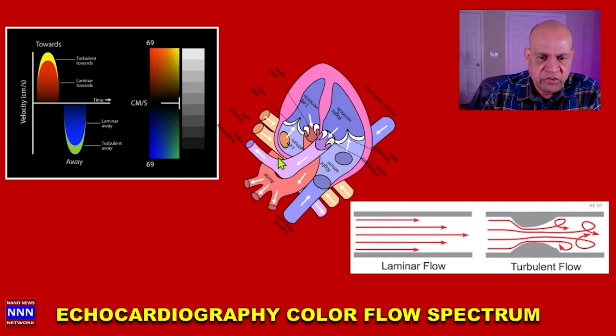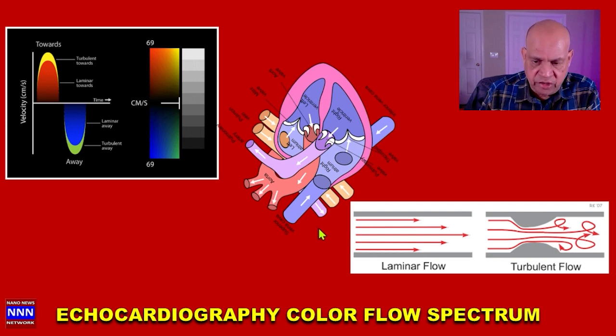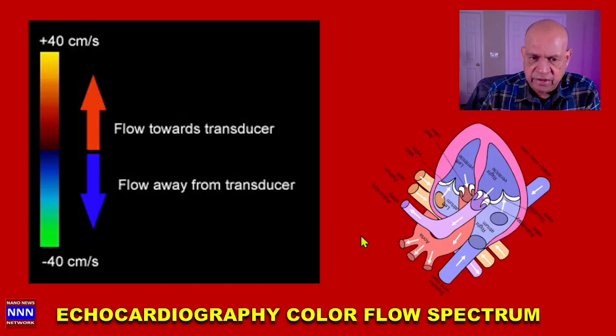the heart. So based on all these factors, the color Doppler is extremely useful in not only visualizing the degree of turbulence, valve regurgitation, but also measuring the amount of valve regurgitation based on certain characteristics. So let us look further and learn more.